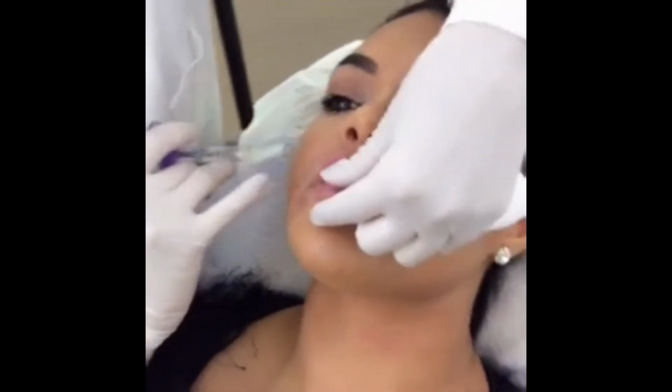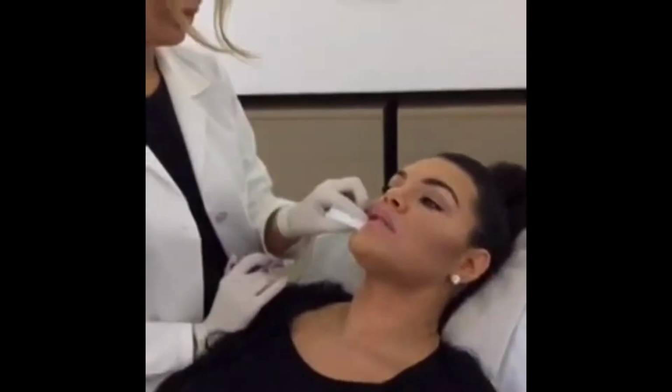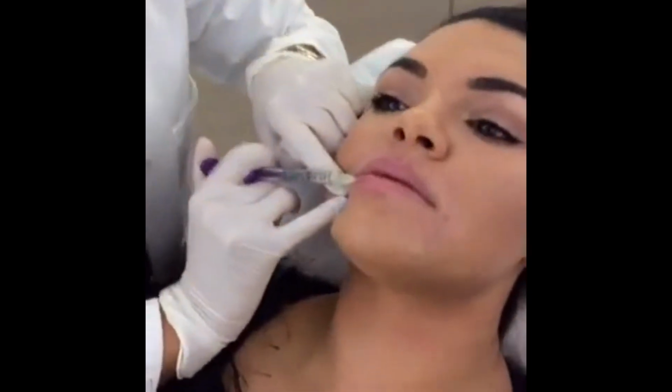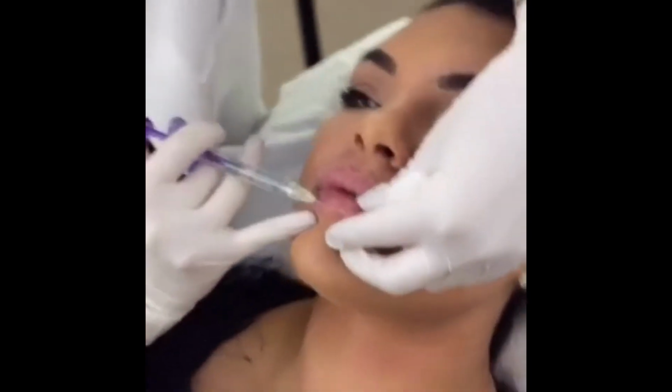So we're creating fullness on the top lip, but Natalie's having to balance it out by putting a little bit on the bottom. Exactly. Because if you say I want a bigger top lip, it's not all about sticking it all in the top. So if you watch, she's placing it. And I think the fashion is, it's not all about just doing the top lip anymore. It's definitely about making sure that the lips look in symmetry, balance, harmony with the rest of the facial features. So Natasha's got great, lovely eyes, cheeks, chin, so she can take a nice, strong lip, definitely. Don't smile.